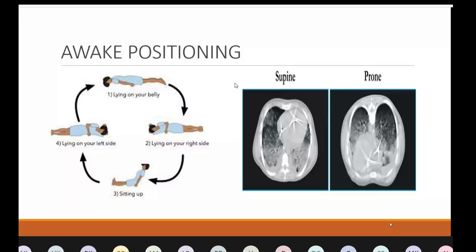There's no pressure coming from the patient. With NIV, if the patient is in distress, he is producing large negative pressures, and along with this large negative pressure, we are also giving a good IPAP and EPAP. So the transpulmonary pressures go very high, and the patient can go in for barotrauma. So always, if the patient is desaturating, keep these things in mind. You always worry about whether the patient will go in for a barotrauma.